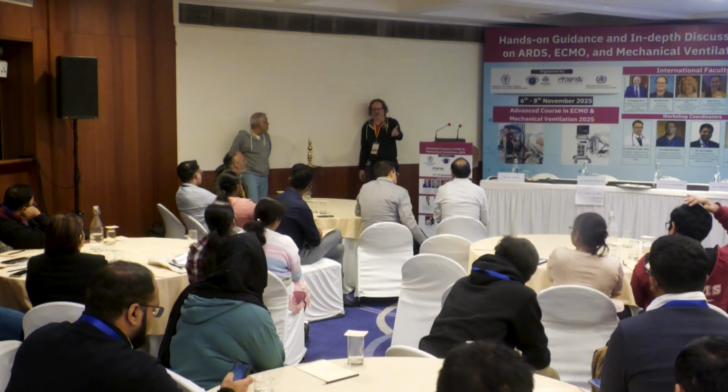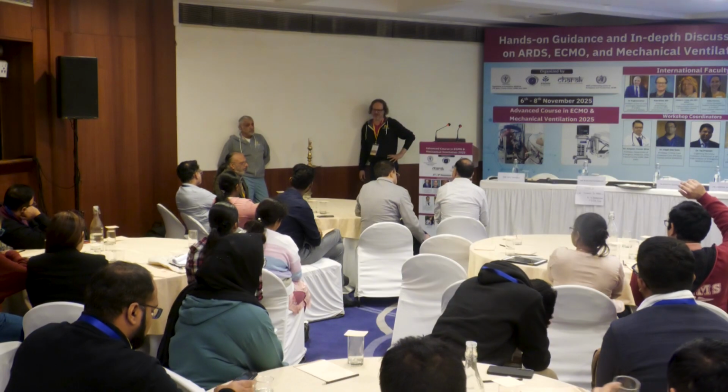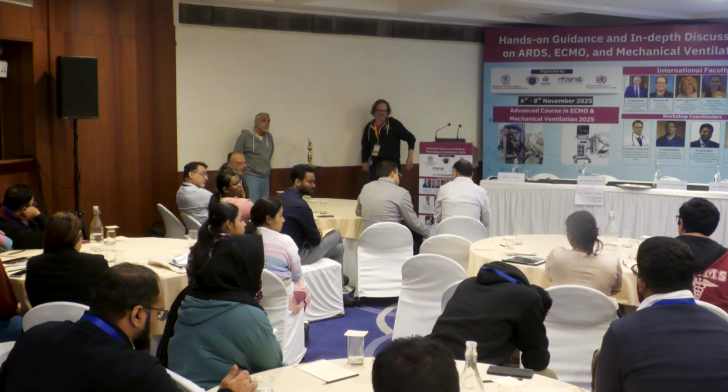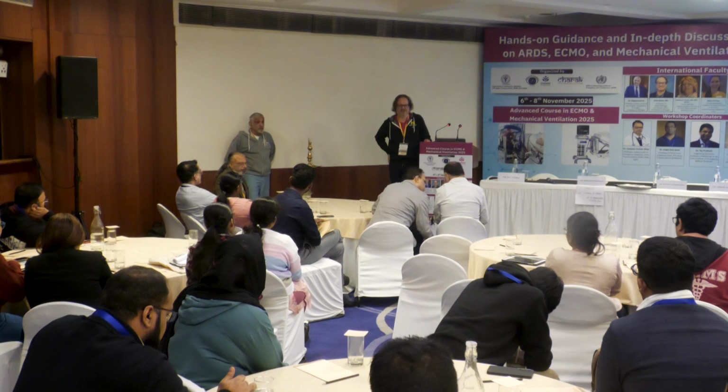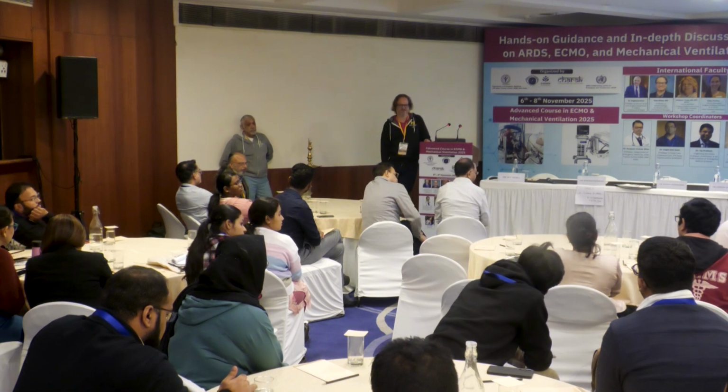Yeah, so it's the OR or interventional radiology as the other option in our institution. In that context, if you are going for an ECPR, you can't take a patient up to fluoroscopy. ECPR is going to be veno-arterial, so how do we know where we are advancing?